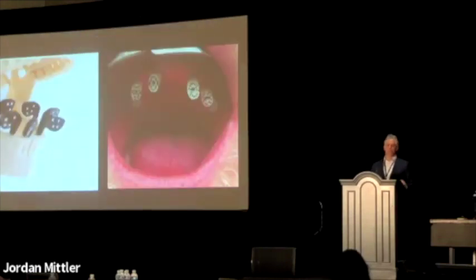Okay. Another thing to consider between systems. If you look at the flags, I'm just going to point over here to the left. The flags are key because the cameras are taking images of one surface. So you have 2 cameras taking pictures of one surface in different positions. Just be aware of that.